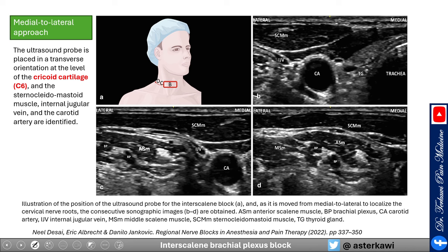There are two ways to perform the interscalene block. The first is to scan medial-to-lateral starting from the cricoid cartilage level at roughly C6. You will see the trachea, thyroid, and common carotid, then move lateral and posterior until you see the anterior scalene, middle scalene, and the plexus between them. The second approach is to trace back from the supraclavicular fossa, starting with the classic supraclavicular view with the first rib, then tracing upward to identify the superior trunk, then C5 and C6 between the anterior and middle scalene.